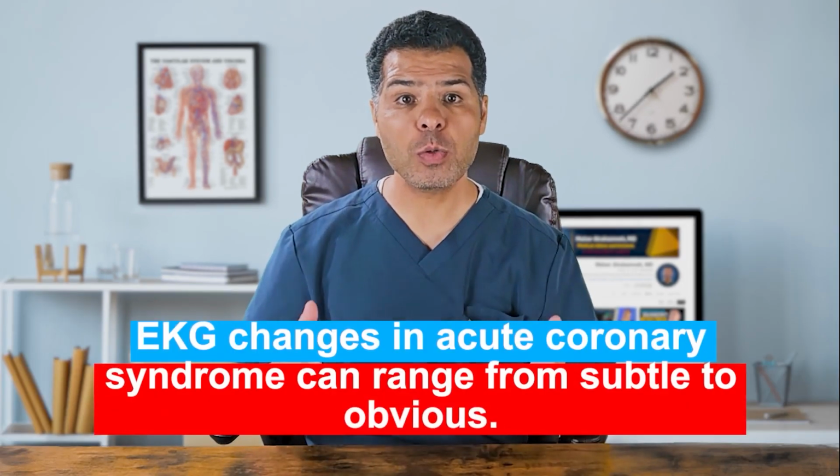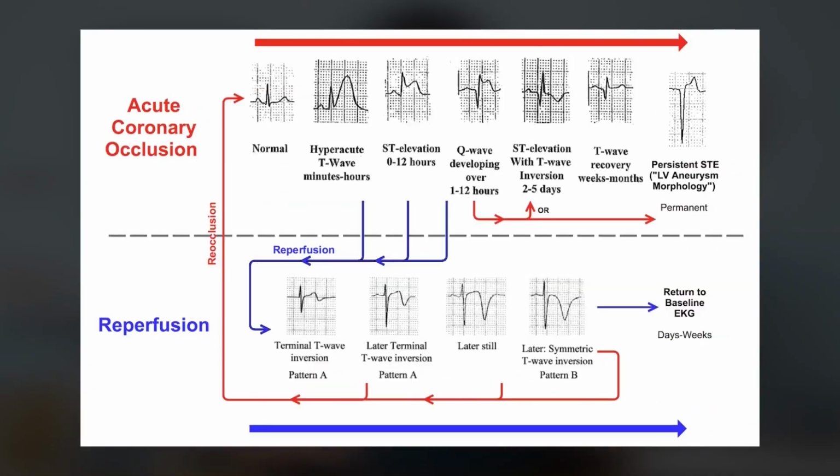EKG changes in acute coronary syndrome can range from subtle to obvious. Take a look at this picture that I borrowed from Dr. Smith's ECG blog. When an acute coronary occlusion occurs, a hyperacute T-wave develops within minutes to hours, followed by ST elevation, followed by the development of pathological Q waves if prompt reperfusion therapy is not provided. If reperfusion is achieved, T-wave inversions develop.